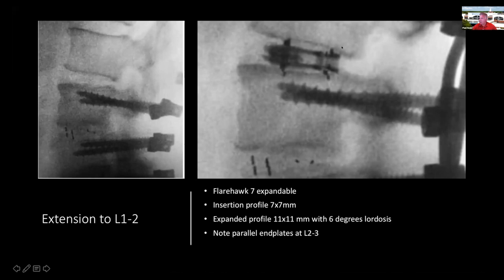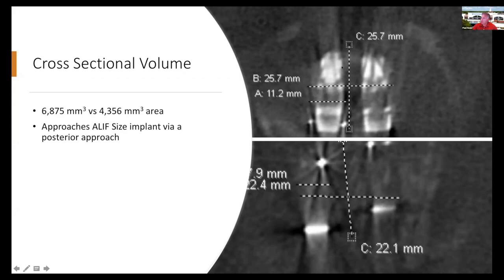At L1-2, the profile of the cage very nicely follows the end plates and creates lordosis. I supplement with posterior instrumentation on all my cases. The expanded cage was 11 mm wide by 11 mm high by 26 mm long, compared to the previous cages at 8 mm by 8 mm by 24 mm. The cross-sectional volume is tremendously larger, approaching the size of an ALIF implant via a posterior approach — a significant advantage when choosing to operate posteriorly.